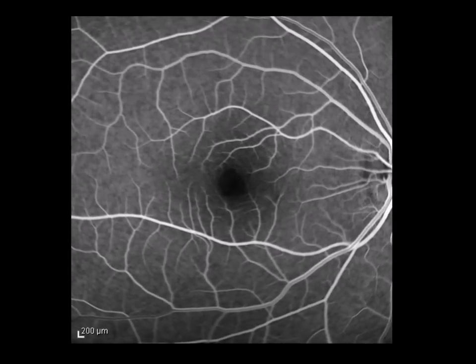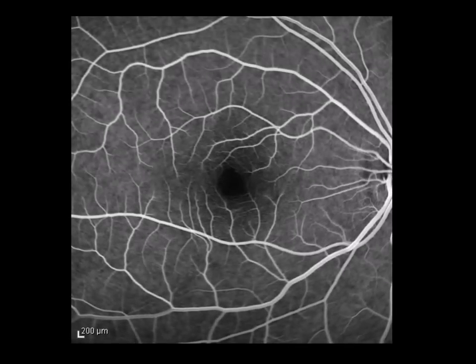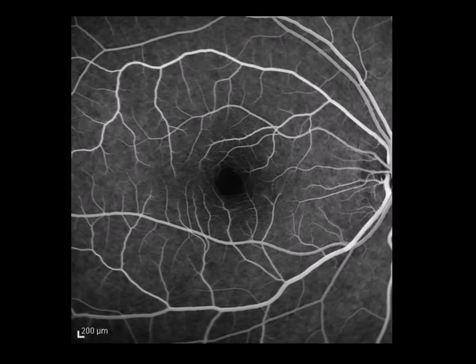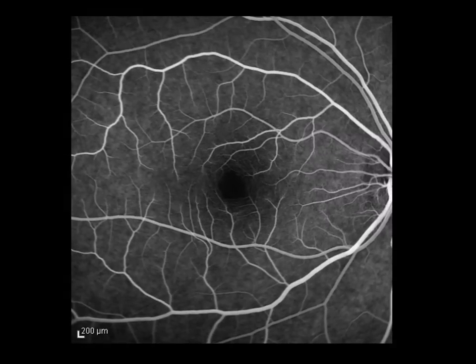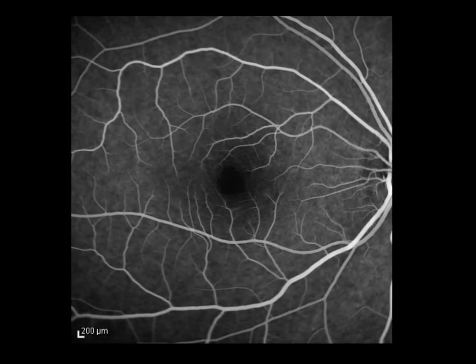So you're not going to see my pointer here that well. But what you're going to see in a second is this patient is vasovagal, so they have a really low blood pressure. So you got that patchy choroidal lobular flush. The timing, of course, is going to be off. And what you see now is the patient kind of falling backwards. Let's see if I can freeze it. That's the patient falling backwards a little bit. I'm just going to page through it because it'll be a little bit easier. See, now you see there are 2 eyeballs, and then they just flashed out.